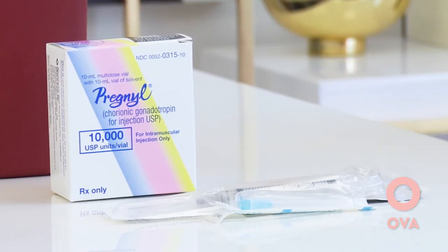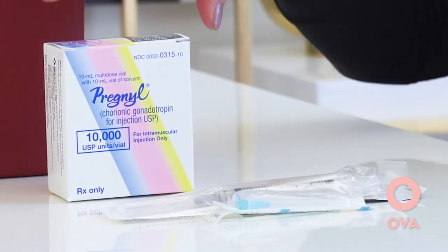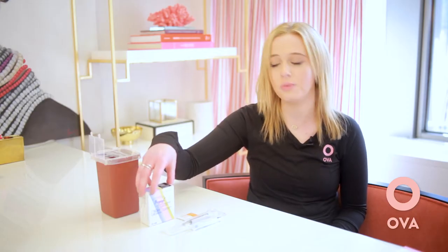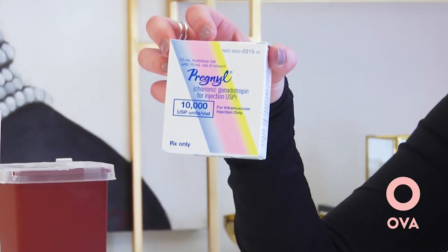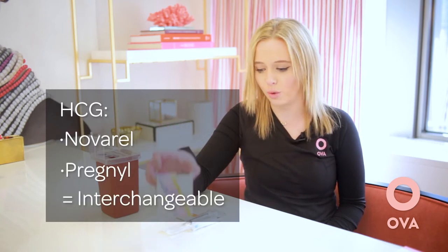First I'm going to demonstrate how to do an HCG trigger. You may be doing 10,000 or 5,000 units of the HCG depending on your dose that your nurse tells you to do. I will go through a 10,000 unit demonstration. You may have HCG, Novarel, or Pregnyl — they are all interchangeable.